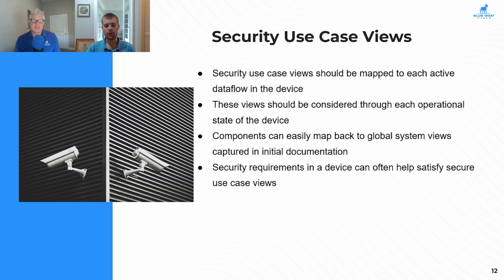This is the proper information that we should be capturing. It hasn't been modified in transit. So doing something like a CRC or a hash of a bit of information to verify that it has not been modified, and checking that hash on both ends can be a great way to verify that we have an intact bit of information. For something like DICOM, we can try stripping out certain functionality and verifying that it's still a DICOM image.